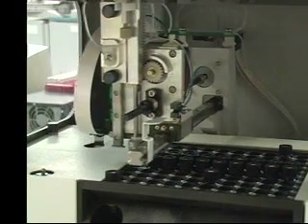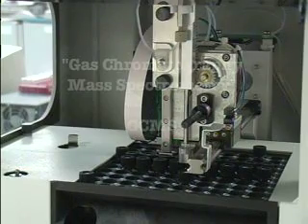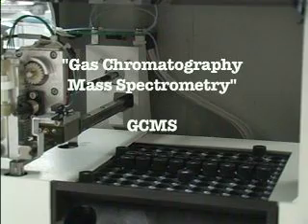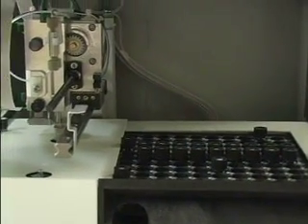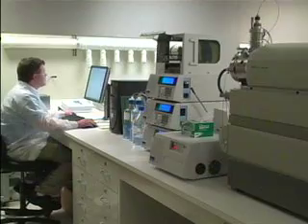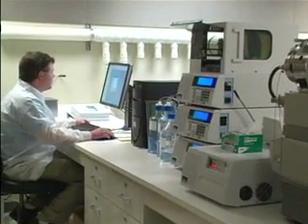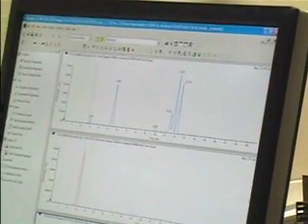Confirmation testing for drugs is performed using LC-MS and/or gas chromatography mass spectrometry, which is commonly called GC-MS. The confirmation testing is used to determine specifically which drug is contained in the case specimen, and it may even be used to determine how much of a particular drug is in the specimen. These quantitations may be important in determining impairment in a suspected DUI case, or if an individual may have overdosed in a postmortem case.